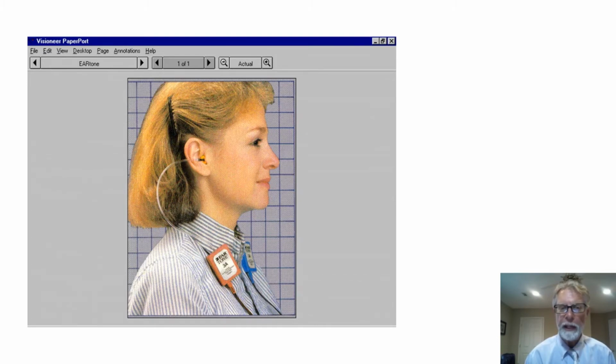And then there is a tube that leads to a nipple, and on the nipple is a disposable ear plug that the patient has in their ear canal here. And you have red for right, blue for left, and that blocks out a lot of external noise too. So that's a very good way to do it. Though most people that use this type of audiometer will be using headphones. These are called insert phones.